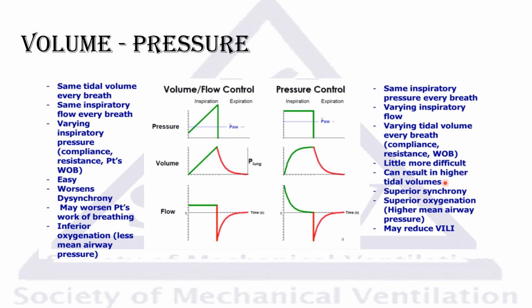It can result in higher tidal volume, especially if the patient starts to actively breathe stronger. Tidal volume might go up. It's better in synchrony, better in oxygenation, and might reduce ventilator-induced lung injury, although again, those are unknowns, which one is better, especially for ventilator-induced lung injury.